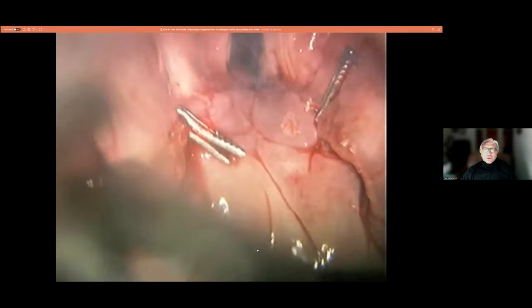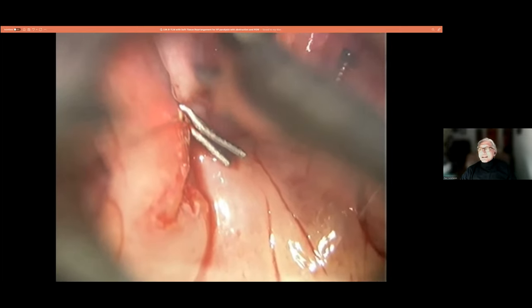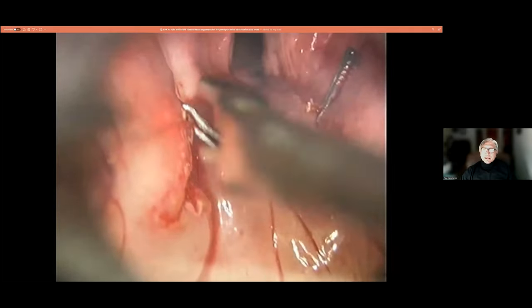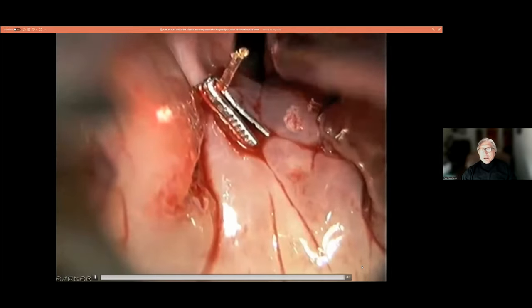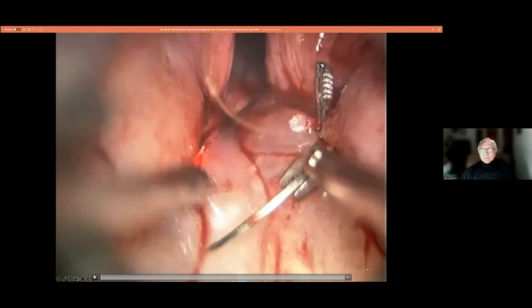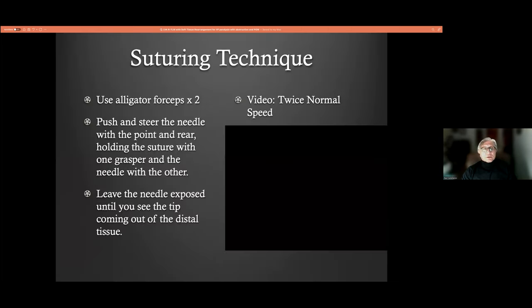What you don't want to do is leave a lot of excess suture material sticking out, because that excess suture material is sensible by the patient. And it's irritating. They feel like they have an insect in their airway, and it's unpleasant. So this I would have cut shorter, also with the laser. Of course, you need to suck the plume away. Right now, that looks like a smoky scene there. But that's the concept. I didn't mean that to go quite so fast.